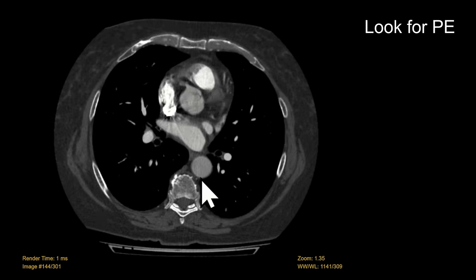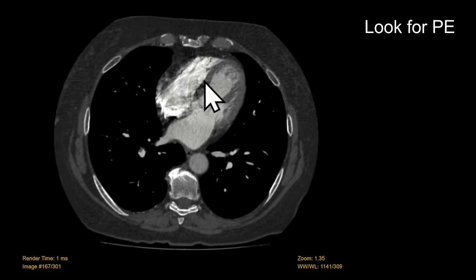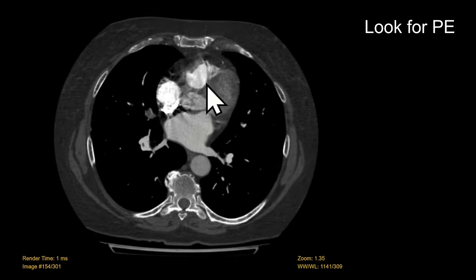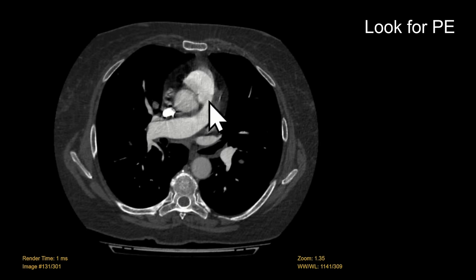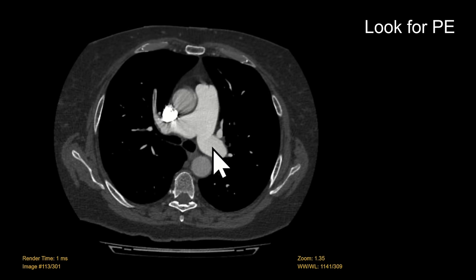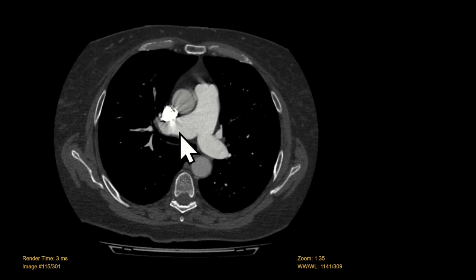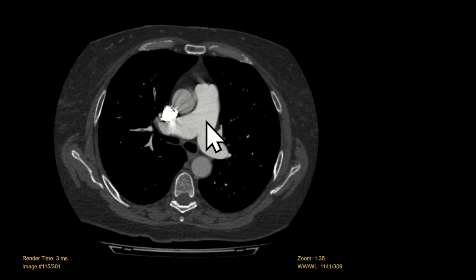We start looking for PE at the level of the right heart, look at the main PA, and then follow out the right and left pulmonary arterial system from central to peripheral. We covered the segmental anatomy in our chest CT introduction video but we're going to briefly touch on it again.